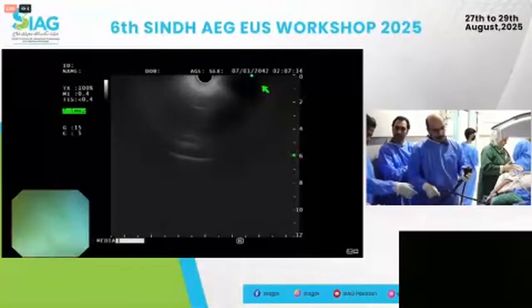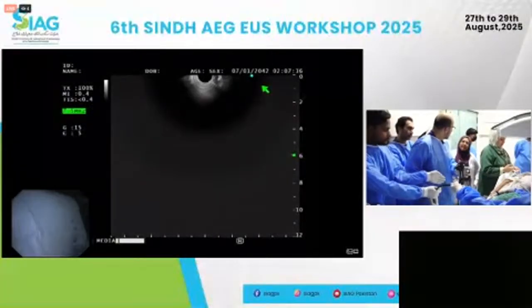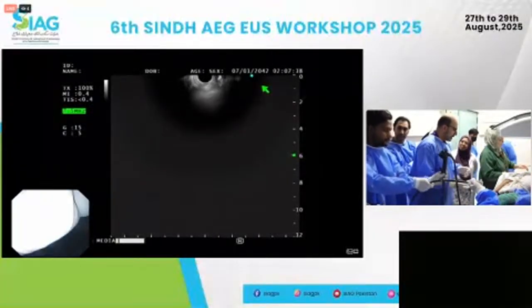Okay? So basically, just intrahepatic stones, repeat ERCP, no mass lesion.